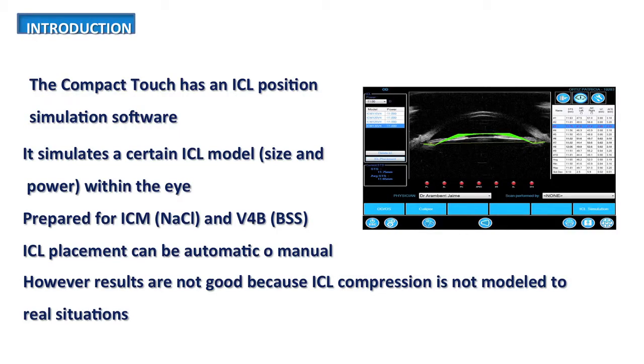I have to say that this unit has in its software a simulation software for the ICL. It's very beautiful, it's very graphic. You can input the ICL model, as you can see here, so that the software simulates the position of the lens. But unfortunately this is not accurate, so I really recommend you not to use it. But I mention it because there might be some confusion on this. So this software within the device doesn't work.